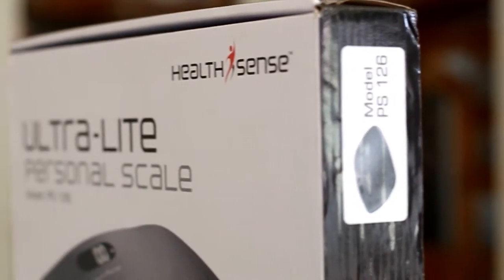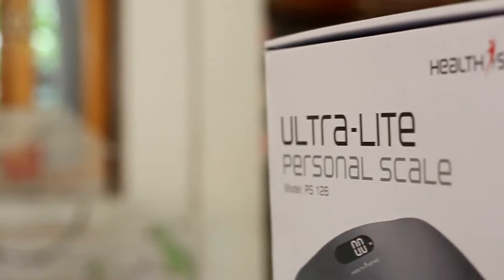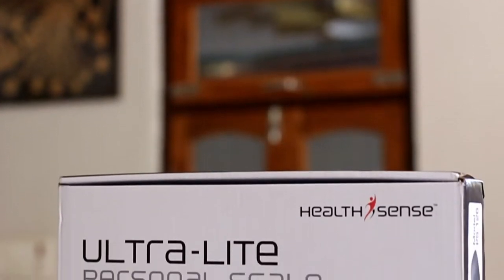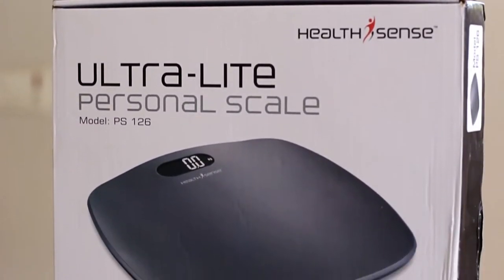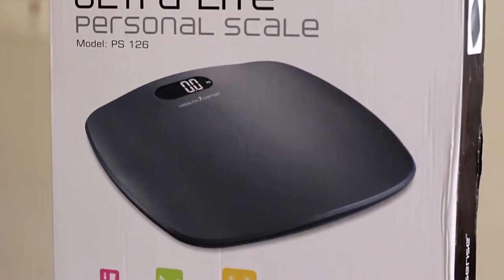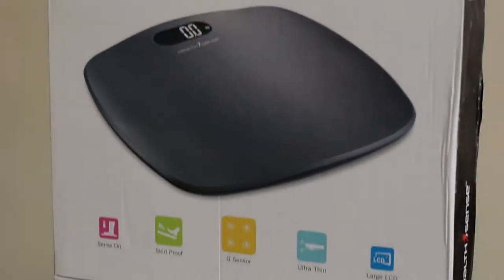Hey what's happening guys, this is Amit here and I'm back with another interesting unboxing review video. This time we are going to look at this HealthSense PS126 Ultra Light Weight Scale. This is how the product comes packaged.